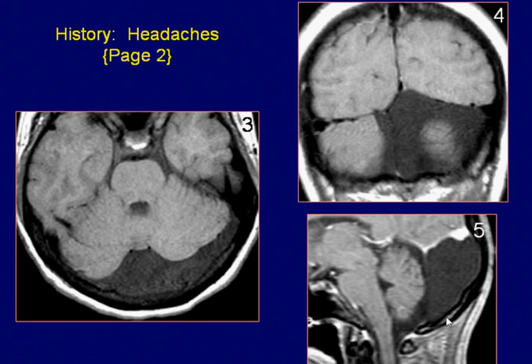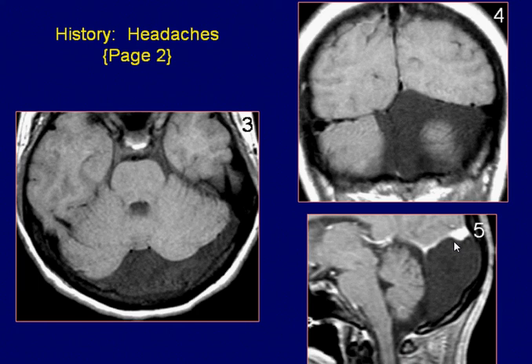Sagittal post-GAD T1-weighted image reveals no enhancement of the lesion. This peripheral enhancement at the upper margin represents enhancing blood within the displaced straight sinus. MR findings are consistent with an arachnoid cyst of the posterior fossa.